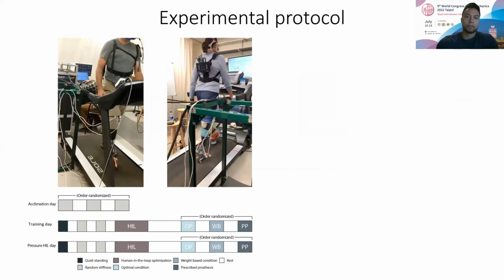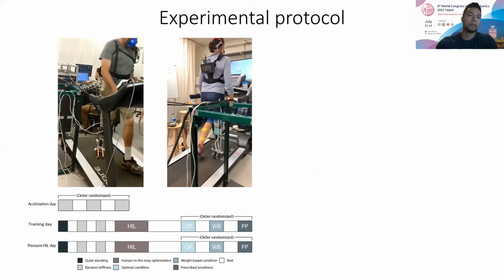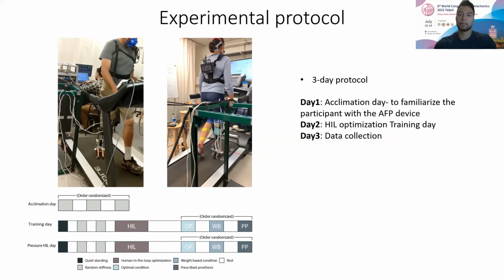For our experimental protocol, on the left-hand side I have a video of both participants walking with the ankle foot prostheses and the entire emulator system and the off-board actuators. Detailed on the bottom is our block diagram, which is a nice visual interpretation of our experimental protocol. It is a 3-day protocol.